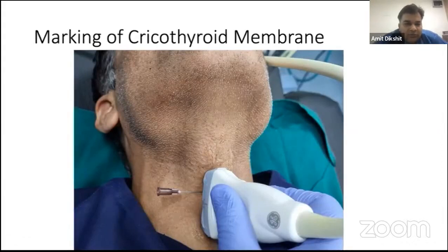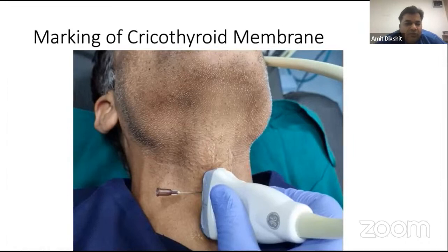Now, what we have learned from experience is how we utilize the cricothyroid membrane when we are called for it. For patients with difficult intubation, say in the ICU, with stridor in sitting position, we have done intubation in sitting position. We have prophylactically placed a 16 gauge cannula there. We punctured the cricothyroid membrane with ultrasound, and then attached a 2 cc syringe, and then, as we know, the 6.5 universal connector and Ambu.